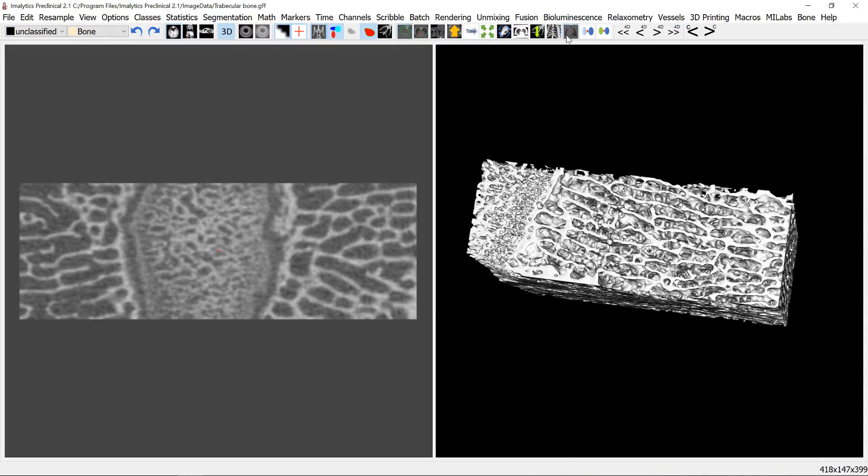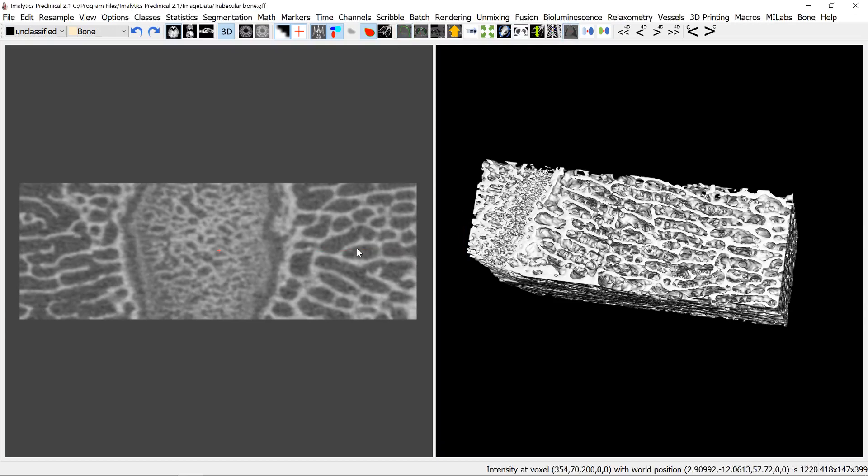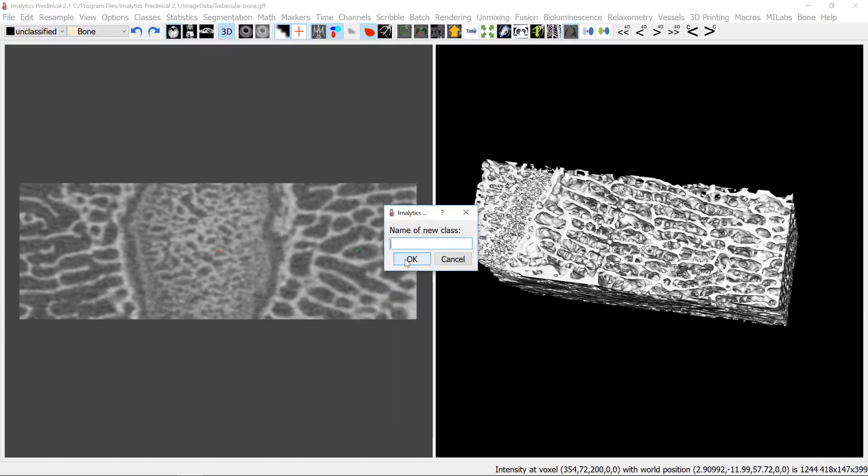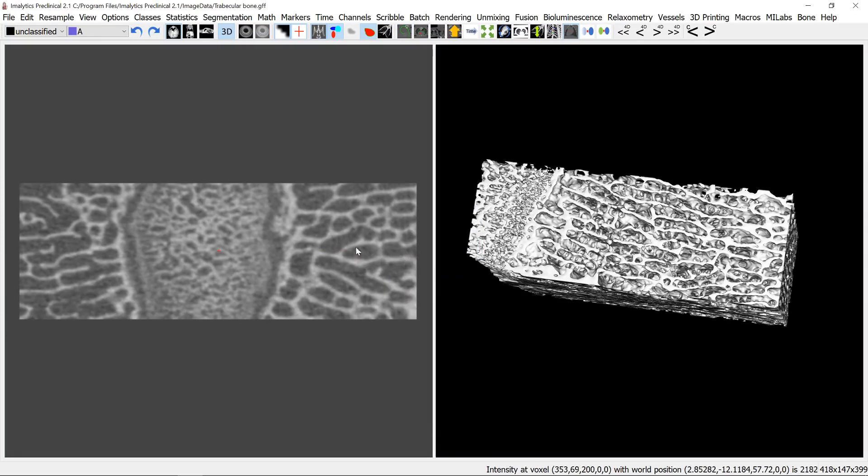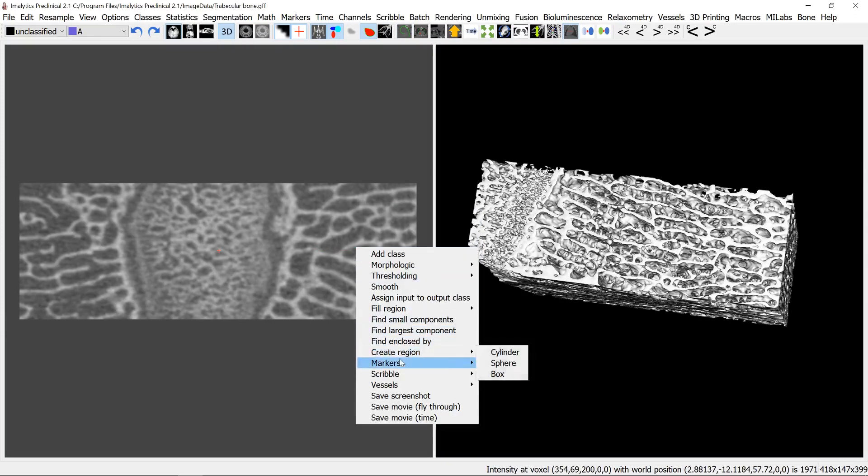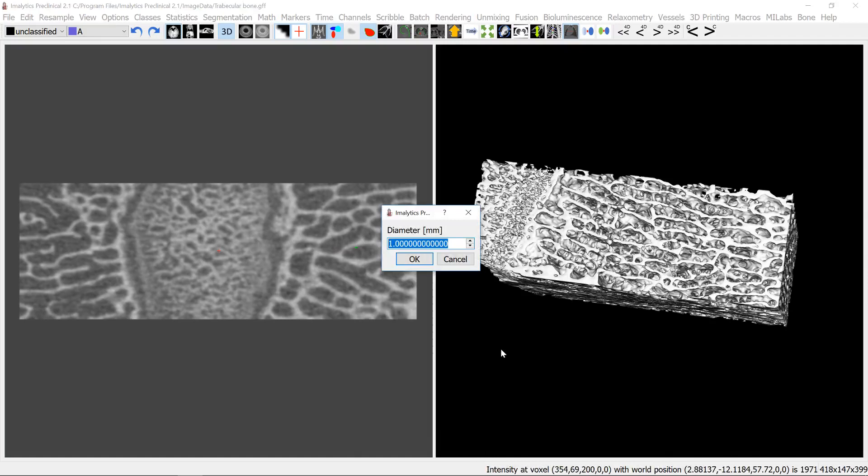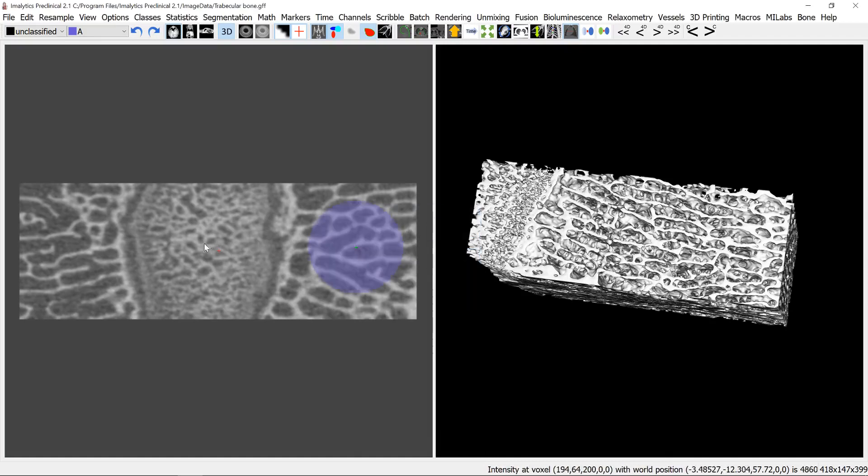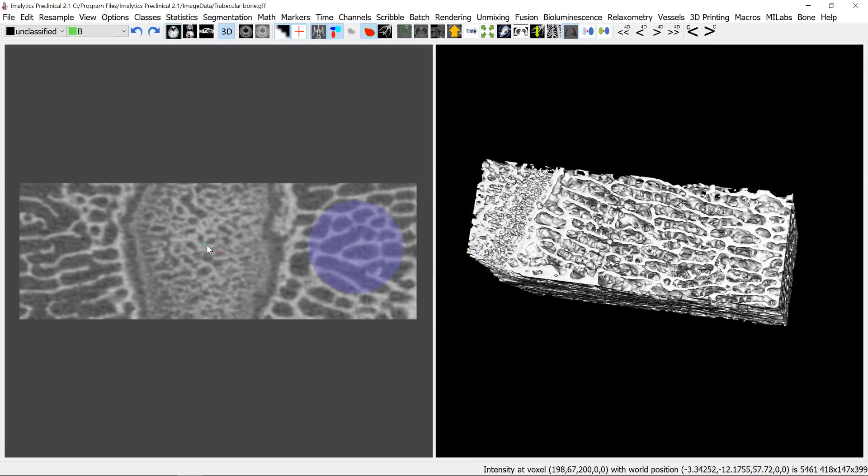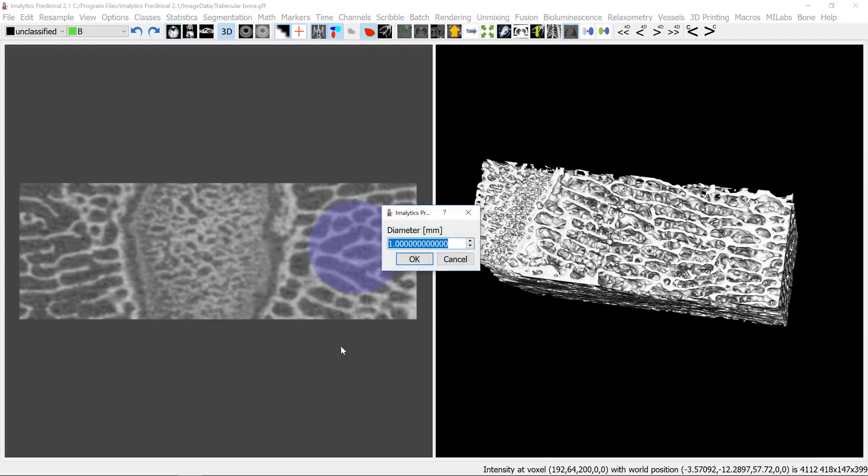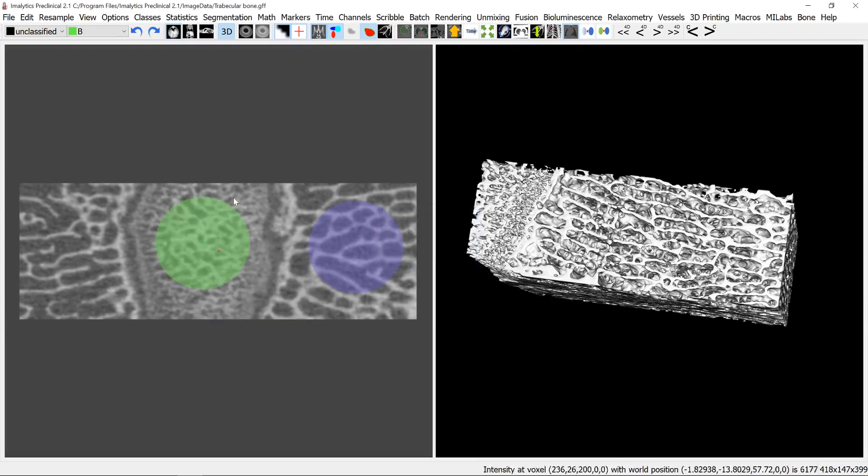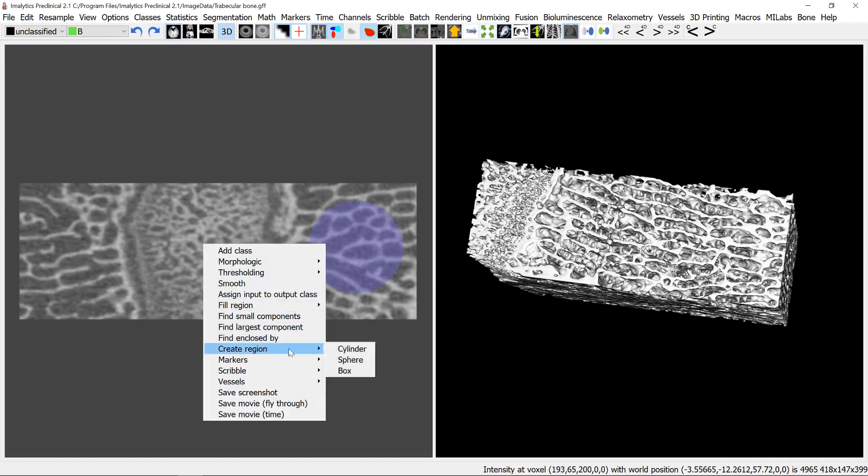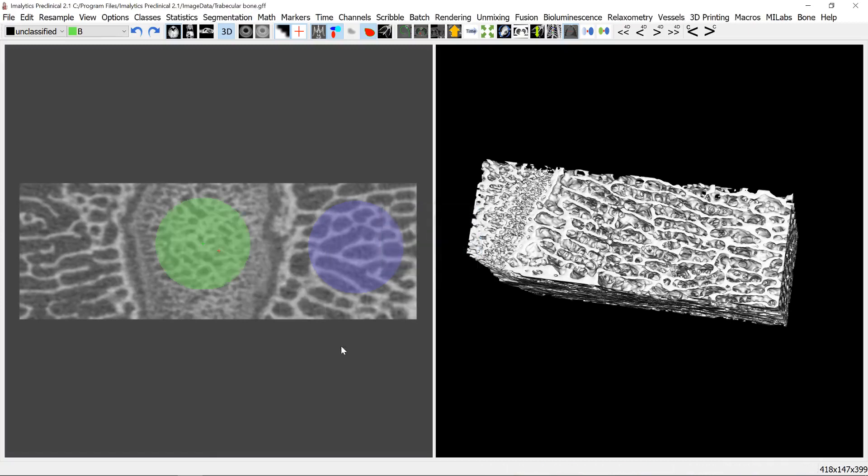For that we need to define a region here. Let's just measure some size, this to get an idea, four millimeters. So let's add a class A here and place a cylinder diameter four and length four millimeters. And here we can add a class B and also add a cylinder with diameter four and length four.